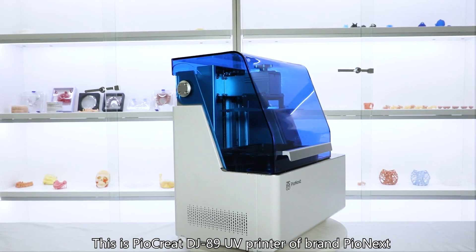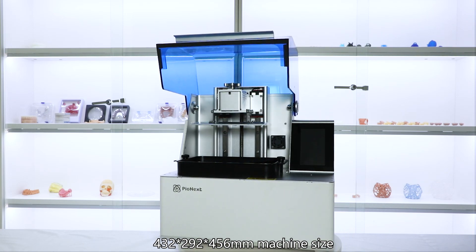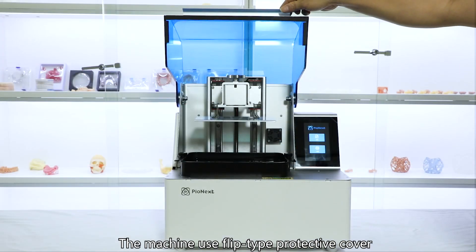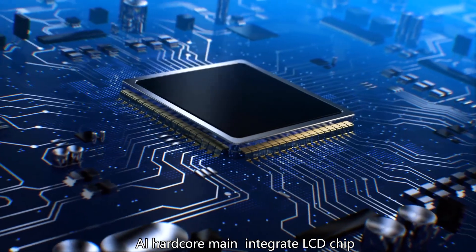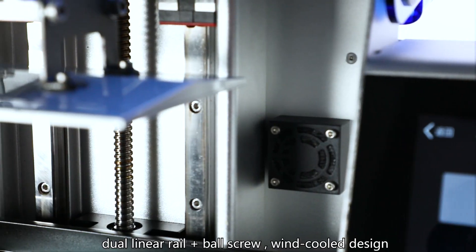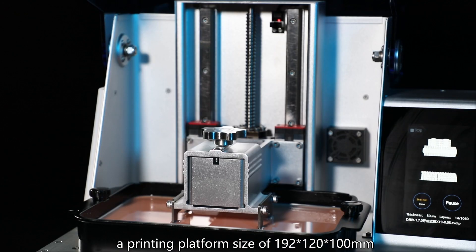This is the DJ89 UV Printer by brand PioNext. Machine size is 432 x 292 x 456 mm. The machine uses a flip-type protective cover, 5-inch HD color touchscreen, AI hardcore main, integrated LCD chip, dual-linear rail plus ball screw, white color design, and a print platform size of 192 x 120 x 100 mm.